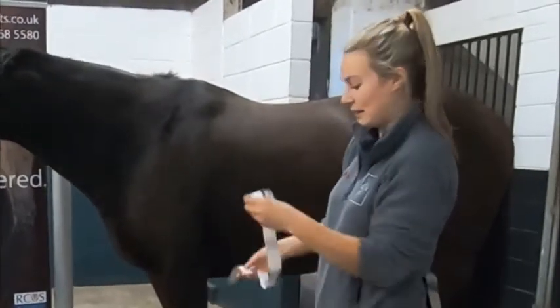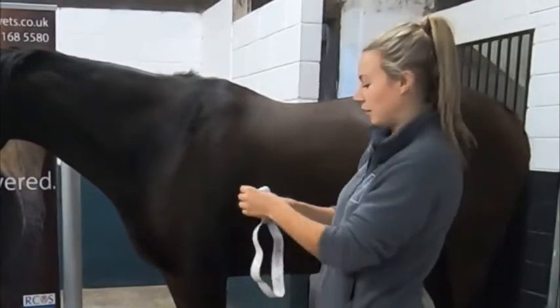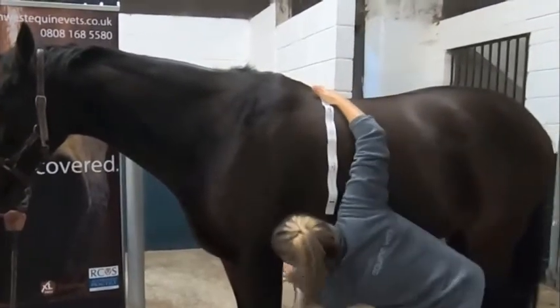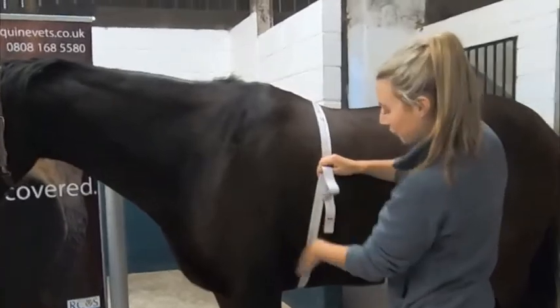Today we're going to use this weight tape. This weight tape is just one-sided — they're readily available and easy to get hold of. We're going to place the tape gently over behind the withers, bring it round from underneath, making sure there's no twists in it, up behind the elbows — we're going to be just behind the elbows.